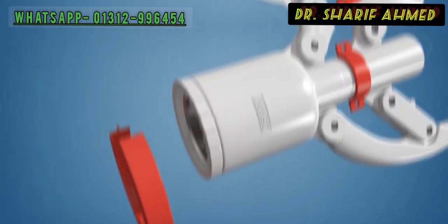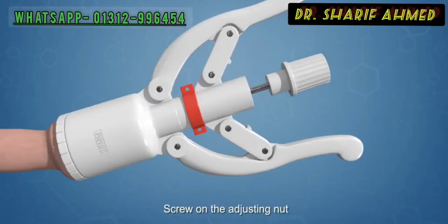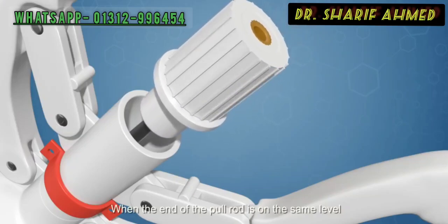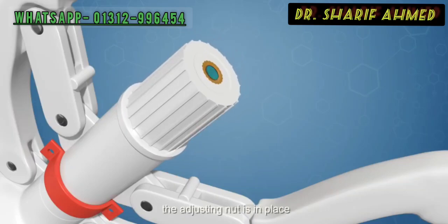Pull apart the nail's cover. Insert the pull rod into the instrument. Screw on the adjusting nut. When the end of the pull rod is on the same level with the surface of the metal insert inside the adjusting nut, the adjusting nut is in place.